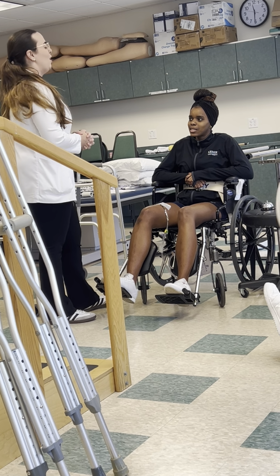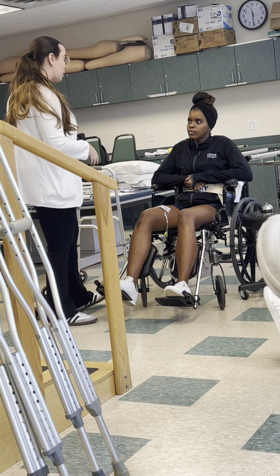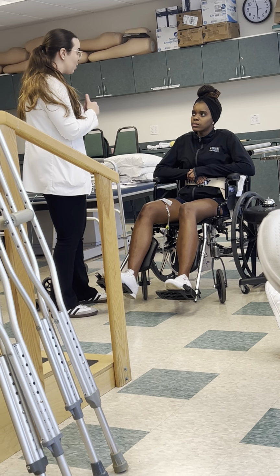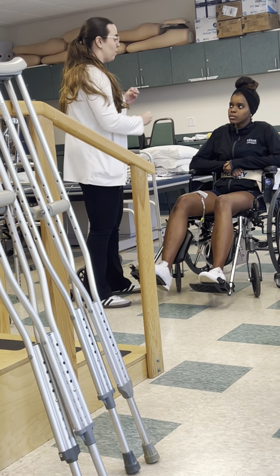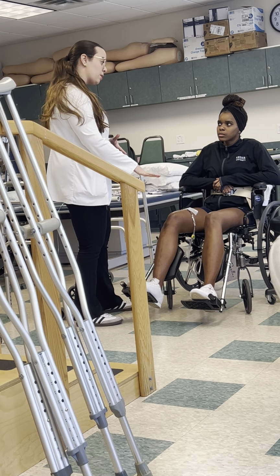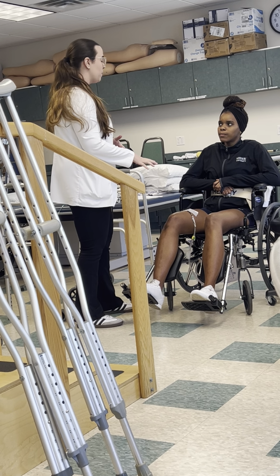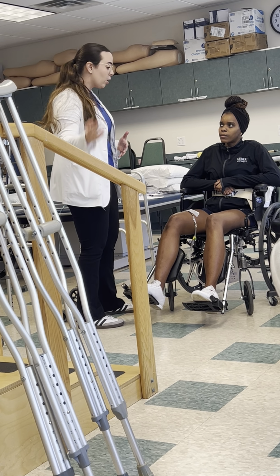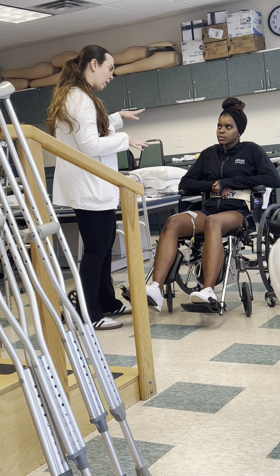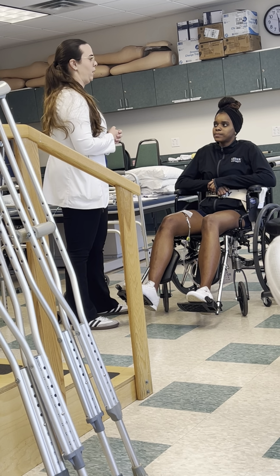Hello Claudia, I'll be working with you today. We're going to be going up and down the steps with your rolling walker. You are going to help me halfway, right? You did great last time, you met me halfway, and I want you to do a little bit more this time, okay? Remember that you can only put 50% of your body weight on your left leg, okay? So make sure that when we are going up and down the steps, you are keeping only that weight that you felt when we were walking, okay? Do you understand? Okay.